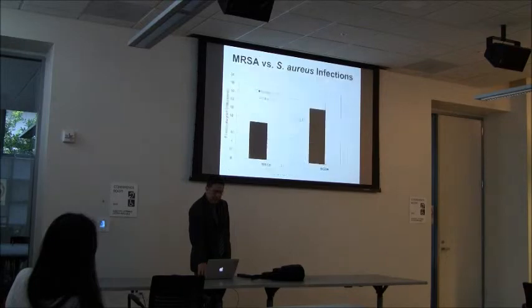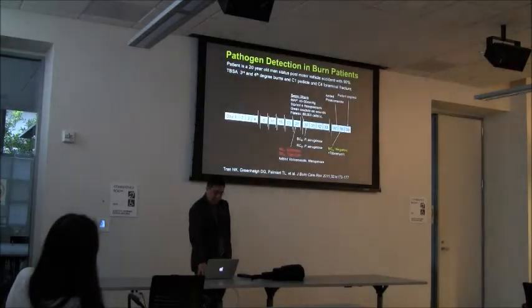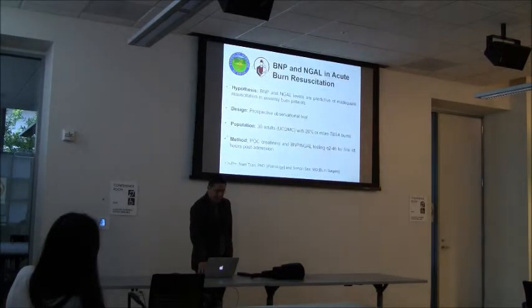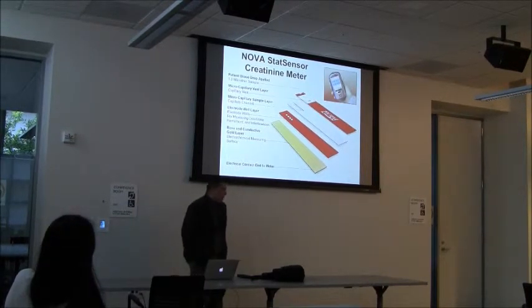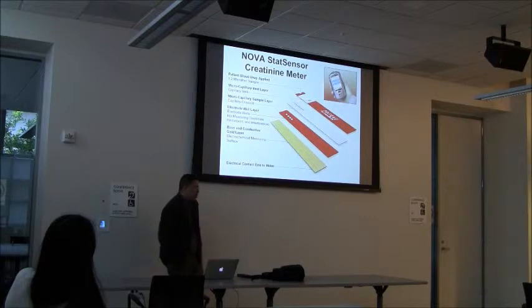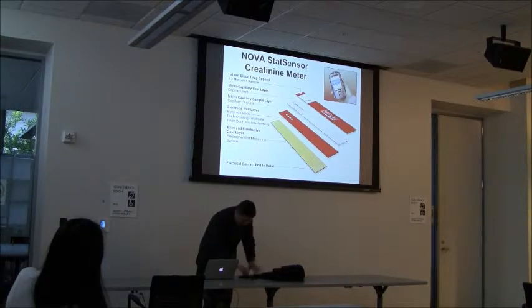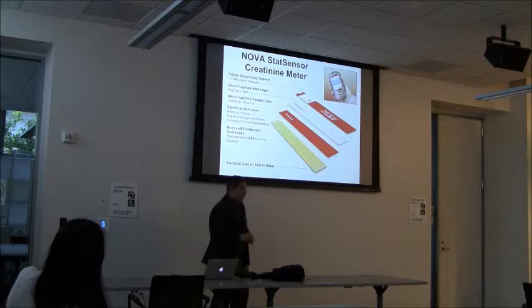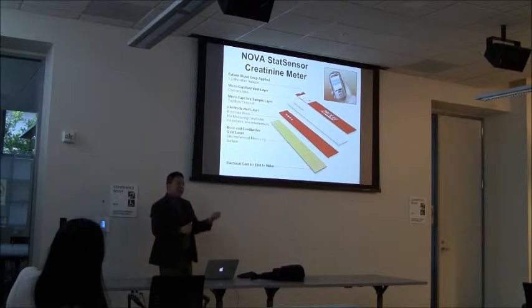I'm happy to send papers on this because we're one of the groups that studied this extensively, and the paradigm is actually glucose. Glucose and the other molecules are very similar because they are soluble in the liquid phase of blood, which is plasma. You put the drop of blood here, and the blood will come in by capillary action and go over these wells. The problem is that glucose, creatinine, all of that sit in the plasma phase, outside of the red blood cells.